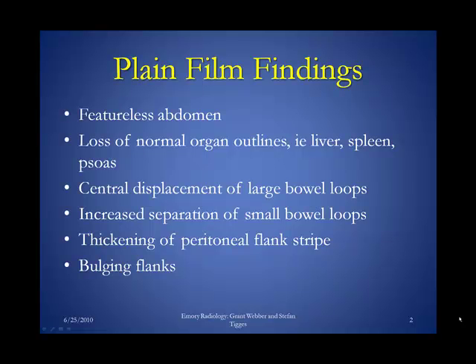You'll be getting central displacement of large bowel loops. You can see increased separation of small bowel loops, thickening of the peritoneal flank stripe, and bulging flanks.